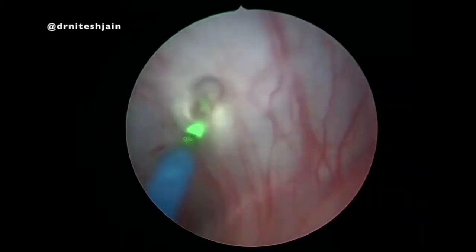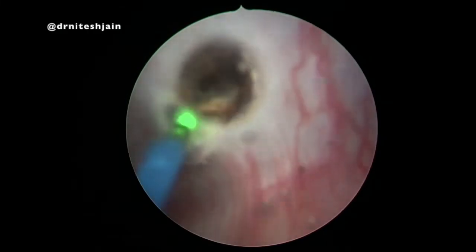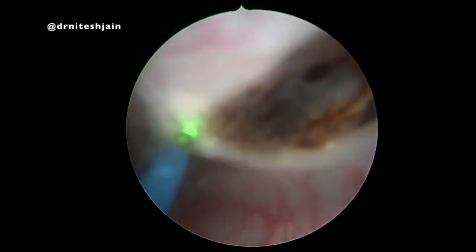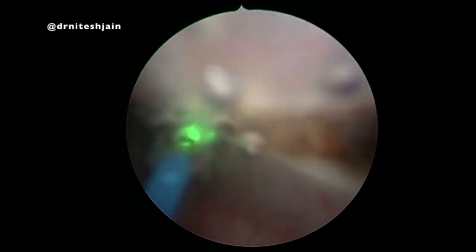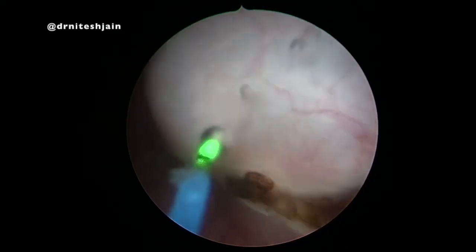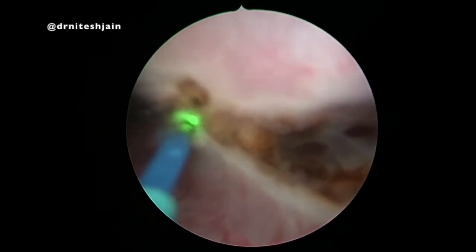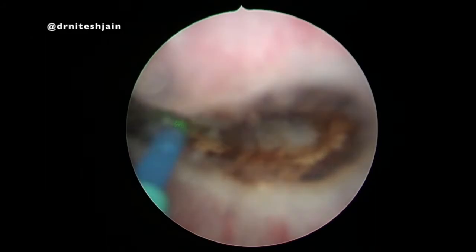Using thulium laser set at 50 watts, the incision is given parallel to the floor of bladder in a smiley shape. The smiley incision is given because the upper flap acts like a valve and can prevent vesicoureteric reflux.